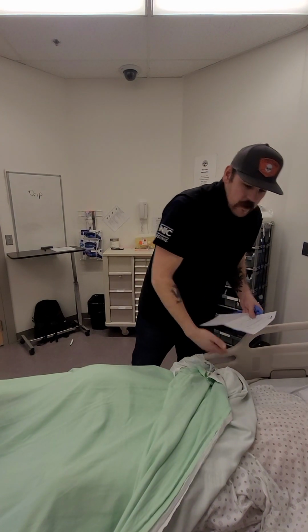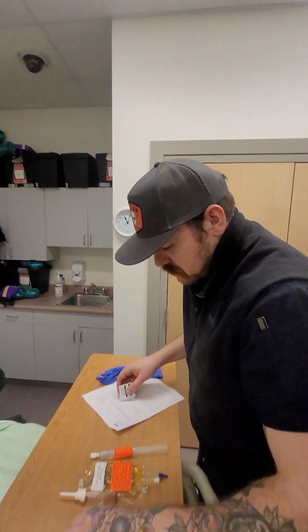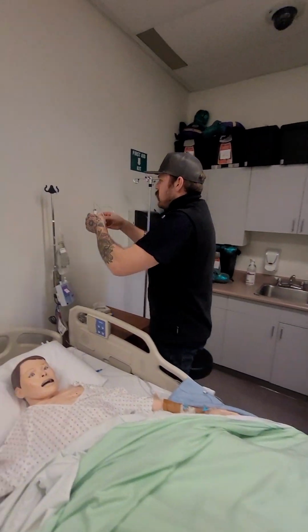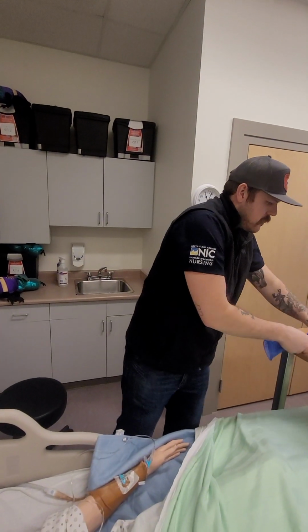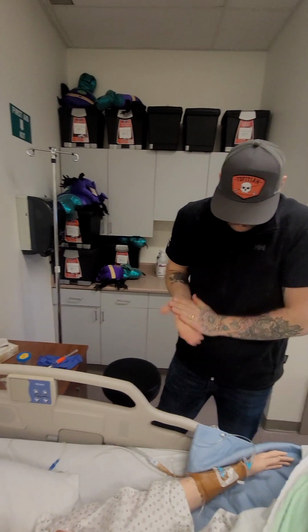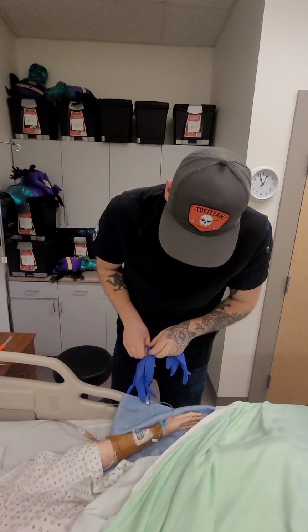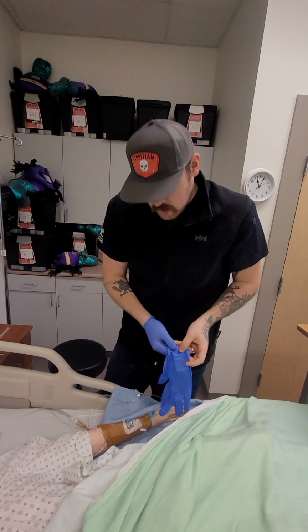Great. So I'm going to be giving you this antibiotic today. It's going to be for your infection, prophylactically or not. So I'm going to hang this bag. Let's get that in a proper space here. And grab my flush, my gloves. So I've got to make sure that the IV is patent. Do some hand hygiene. Don some gloves. Have you had any problems with your IV today? No, it's great. No? Okay. Lovely.